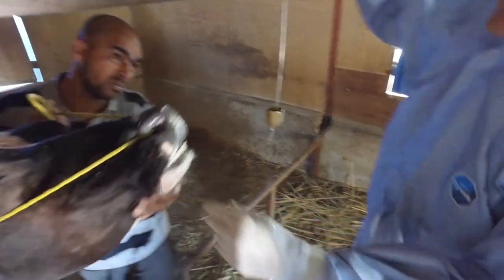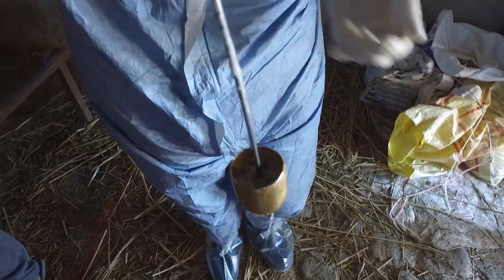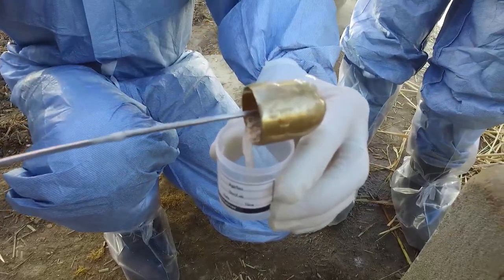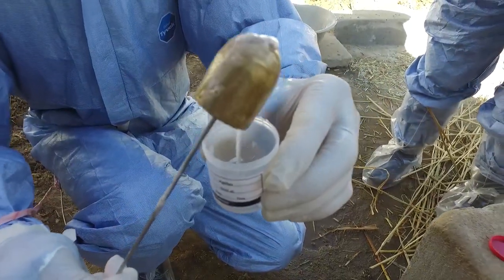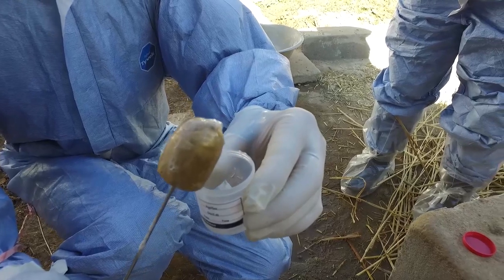Lift the head of the animal and remove the probang in a swift upward motion so that the sample is kept in the probang cup as you remove it. Pour the sample into a wide-neck container with an approximately equal volume of neutral pH buffered medium with added antibiotics.